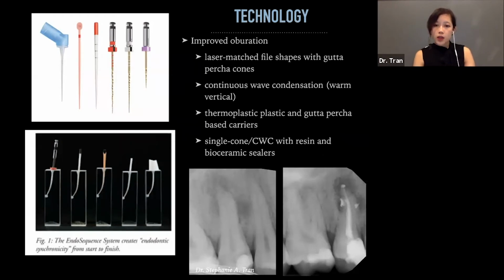So we can see in the radiographs, this was a case recently where I could tell from the shape of the periapical radiolucencies, how it's like 3 lobes, that there would probably be 3 areas where the canal system went, and sure enough, I was able to adequately clean it in a minimal way. So I actually did a caries leveraged access into it. And the obturation showed lateral puffs in all those areas. Those 3 lateral puffs, actually almost a 4th one on one of the canals, tell me I was able to adequately seal the canal system.